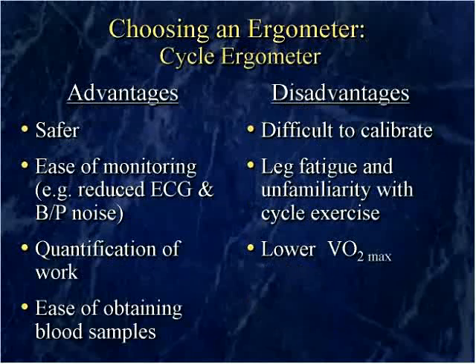The disadvantage of today's modern cycle ergometers is that they are difficult to calibrate. Matter of fact, there's no way to calibrate them other than using biological controls, and we'll talk about that a little bit later. I really shouldn't say there's no way, but the calibrators that are associated with them are rather expensive. I think they cost about $5,000. They actually apply a motor to the flywheel, and they can figure out or calibrate the output.